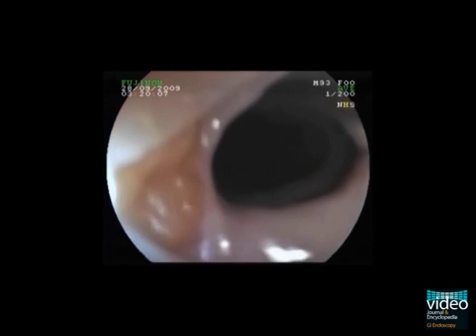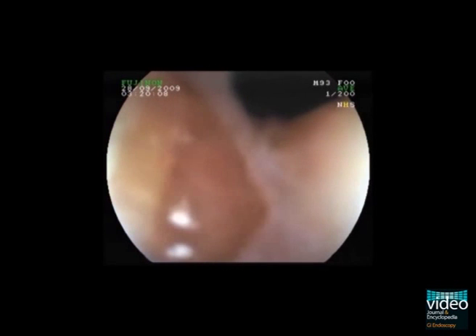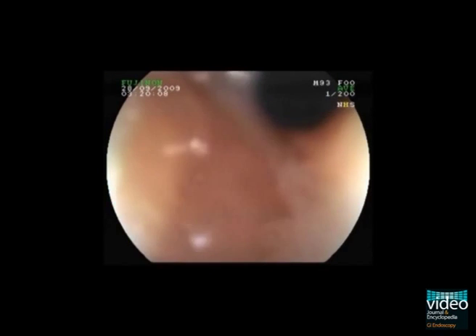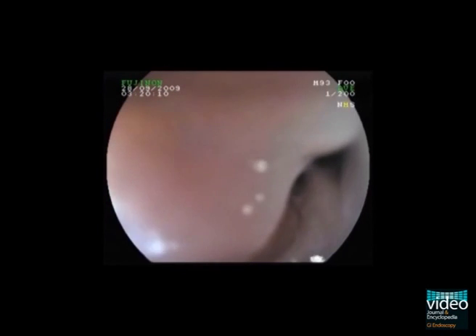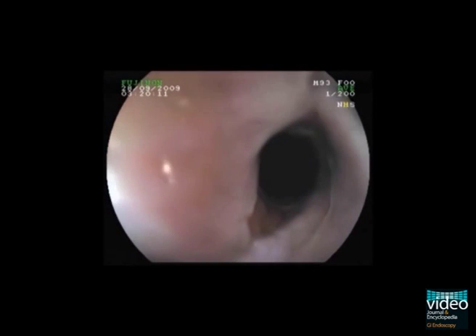Water is inflated using the water flush of the endoscope in the attempt to remove the fibrinous exudates from the mucosal surface. An island of heterotopic gastric mucosa becomes visible in the lower left part of the endoscopic image.